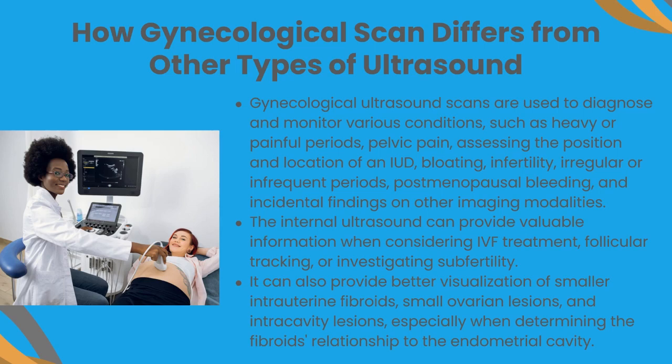The internal ultrasound can provide valuable information when considering IVF treatment, follicular tracking, or investigating subfertility. It can also provide better visualization of smaller intrauterine fibroids, small ovarian lesions, and intracavity lesions, especially when determining the fibroid's relationship to the endometrial cavity.